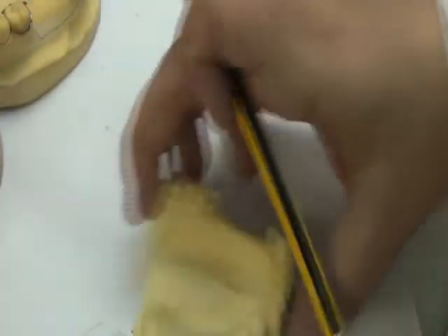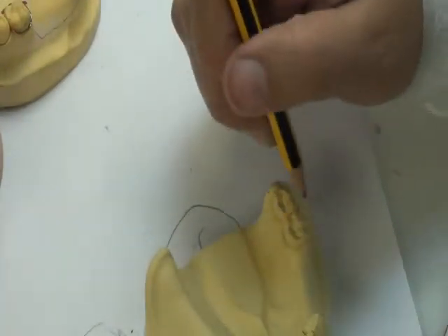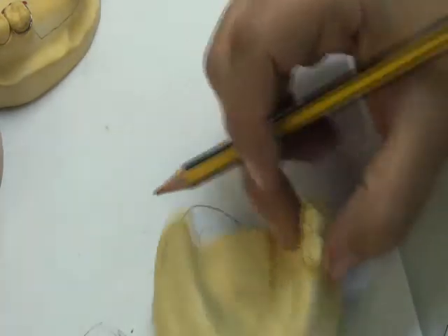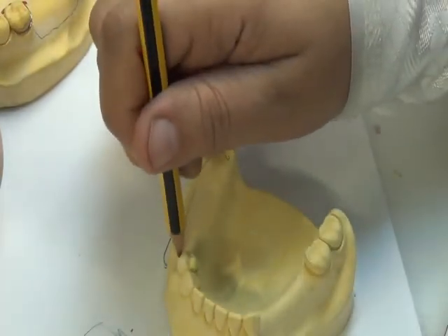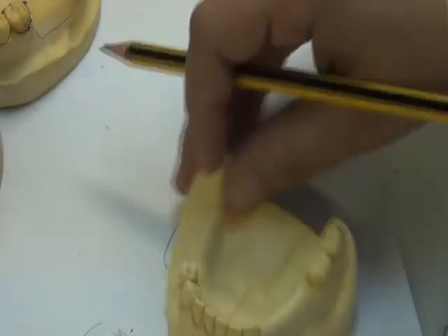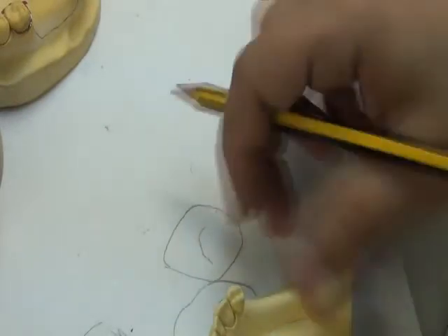The lower, the bounded saddle area, this tooth will have a clasp because it's an abutment. We go lingually and come down. This is a free end saddle area. I follow denture rules, so I go as much as possible posteriorly and as much as possible buccally to get support, and as much as possible lingually, governed by the border areas, and go back vertically to the tooth.